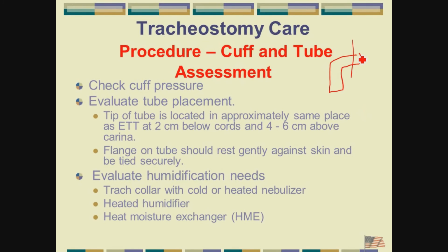There are problems that can happen because that trach tube can be tipped in this fashion, which means that this back end is eroding the tracheal wall. So you want to make sure that the tracheostomy tube is properly positioned. There are some kids up at camp that, just over time because of neglect, their trach is all contorted, and you know that the trachea on the inside is just a living mess that we're going to have to deal with later on.